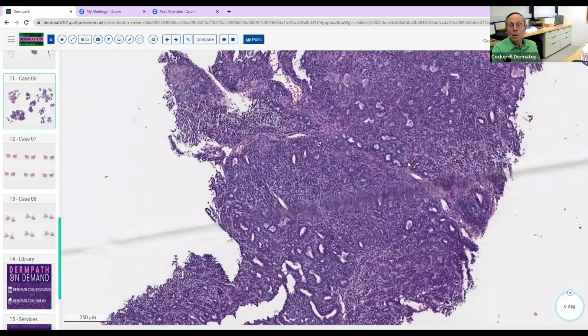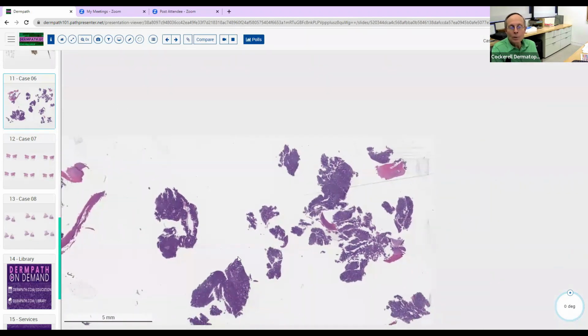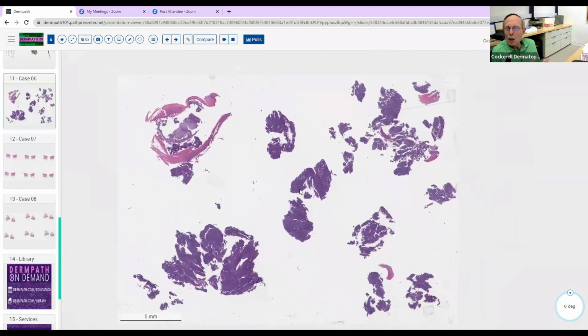I'm not sure what they thought this was. They might have thought it's a glomus tumor or something, and so they did an incisional or enucleation biopsy here. That's why it's all fragmented, with all these multiple aggregations. A lot of times with these subungual acral lesions, they're not so easy to biopsy unless you take a broad incisional biopsy to get it out en bloc. You'll see people take shaves and curette the base and things like that. So this is commonly what we get here. We don't really see a classic nice example like the last one, a punch biopsy of a lymphoid lesion. So this is an aggressive digital papillary adenocarcinoma.